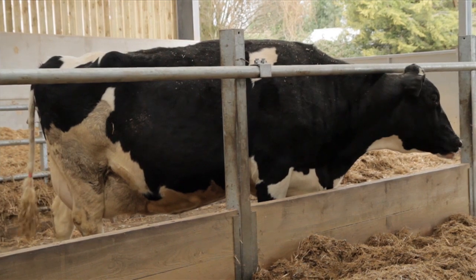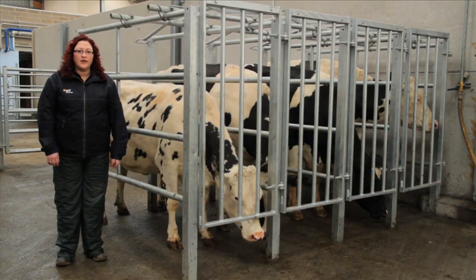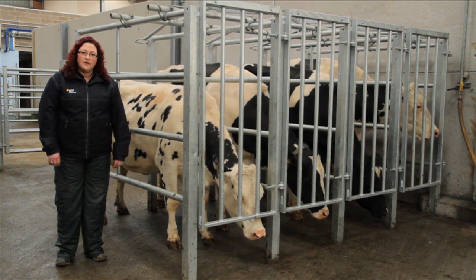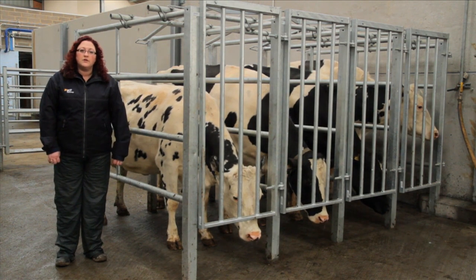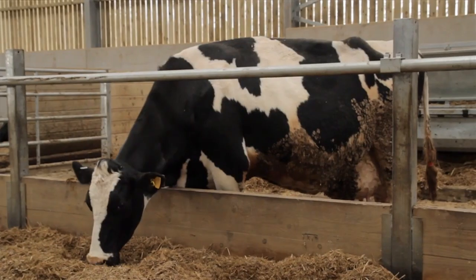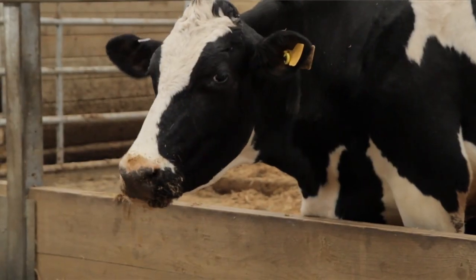Ultrasound can be used to not only diagnose pregnancy in cattle, but it can also be used to evaluate the various structures of the reproductive tract, including the ovaries, the uterus, and also other structures such as the cervix and the vagina. This will allow us to be able to better integrate the information gained from these types of examinations into the management protocol of the farm.